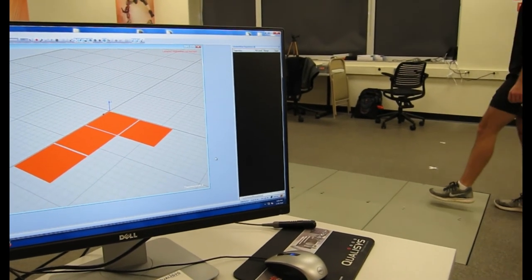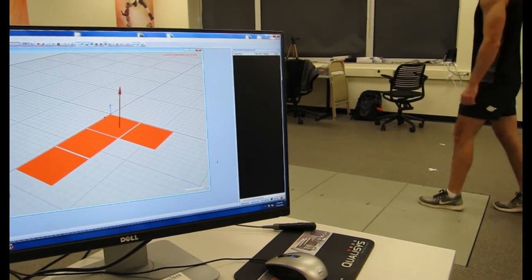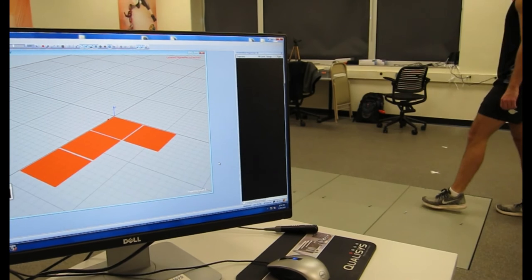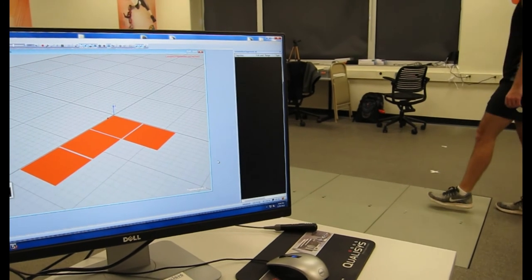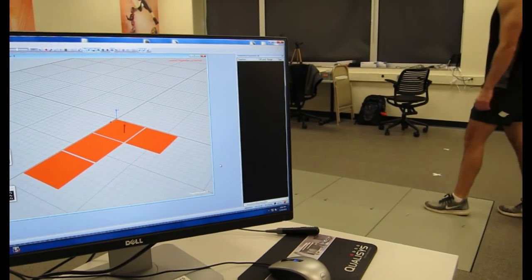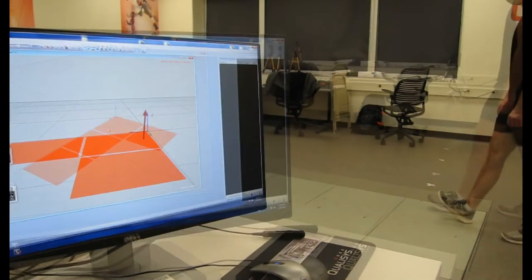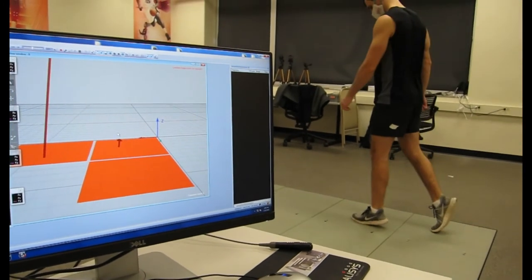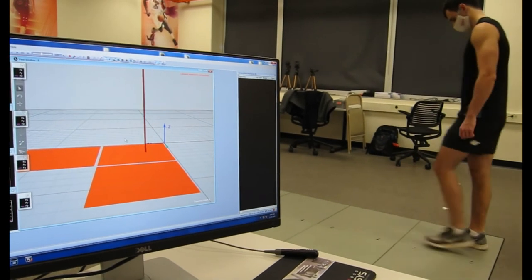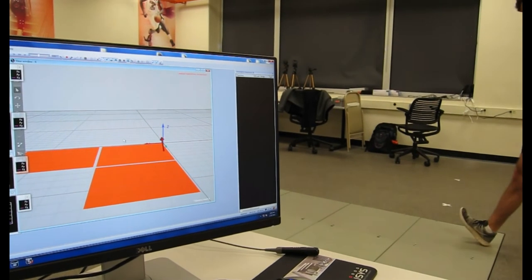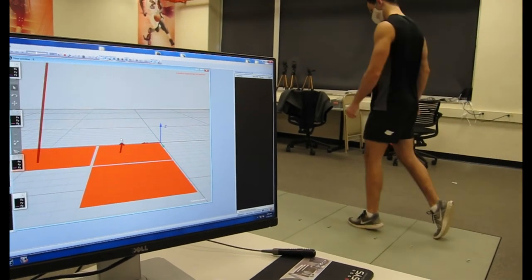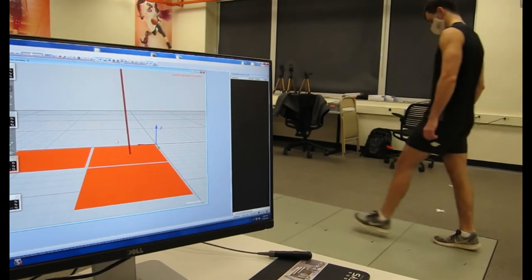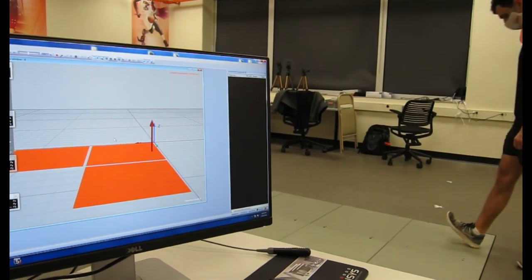On the computer screen the force is shown by an arrow. The bigger the arrow the bigger the force, and the direction the arrow points shows the direction of the force, generally progressing in the direction as a participant passes over the plate.